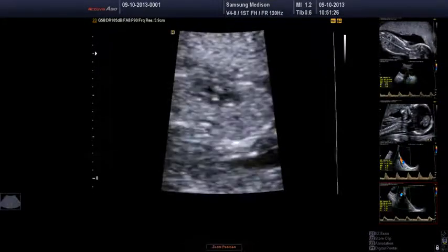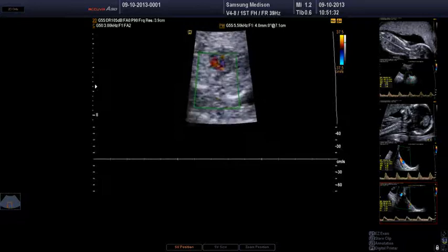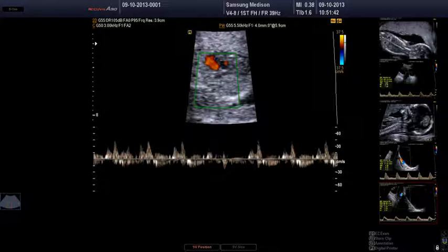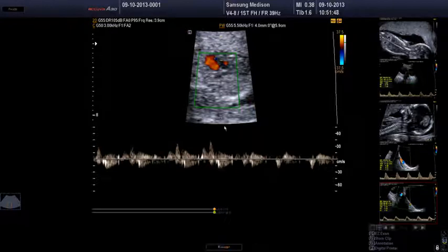Okay, I was just trying to demonstrate that if you look at the left ventricular outflow tract as well, then you actually obviously get that waveform when you put the gate on as well. So we'll just perhaps bring the gate up there and let's see what we get there. So this is probably left ventricular outflow tract just here, not particularly good demonstration, but you can see that this is just coming down to about 30 centimetres per second, and it's usually quite pyramidal in shape, rather than being the sort of higher flow rate that you get with tricuspid regurgitation.